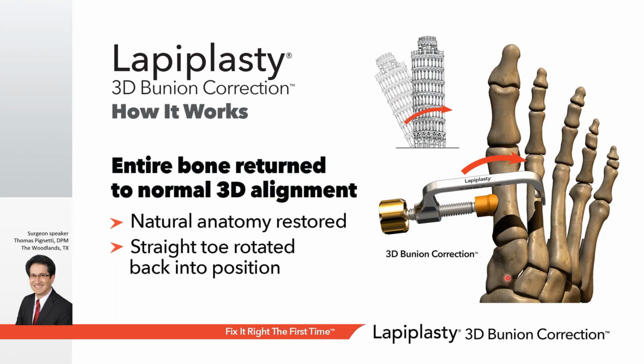Typically when these fusions were done in the past, not in Lapiplasty form, surgeons would look at how they wanted the bone to end up after the procedure, and they would cut wedges of bone out, freehanding it, basically eyeballing it. What the Lapiplasty does is before we cut anything in terms of bone, we utilize this instrument to actually rotate and pivot the bone back in place.